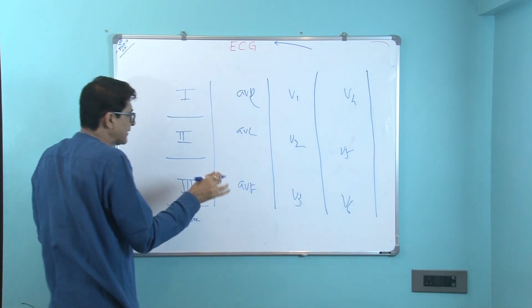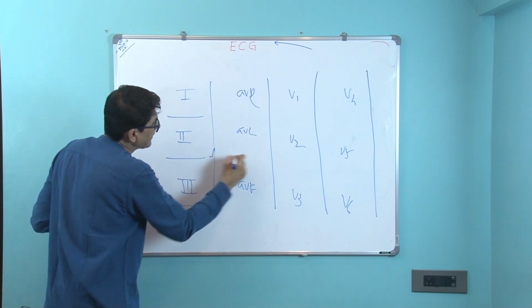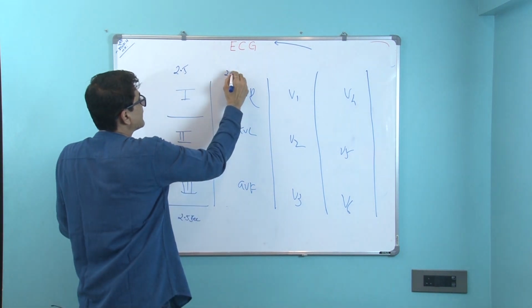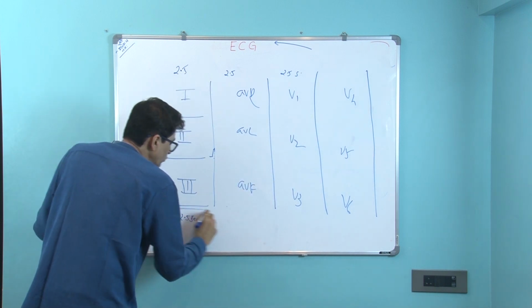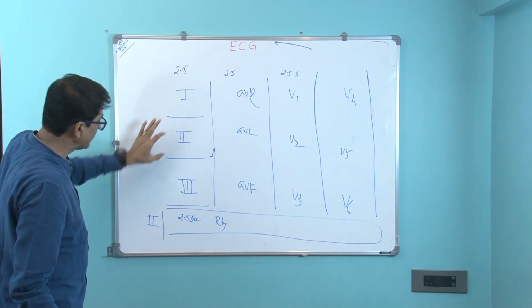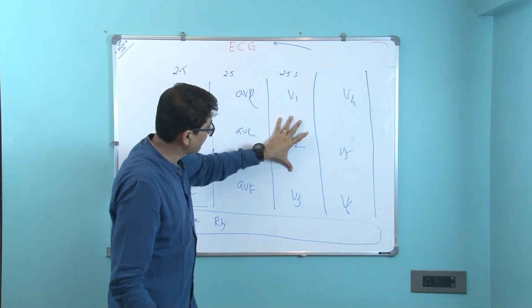So how much complex does it come? Even if an R wave is coming here, it will automatically get cut off and another lead will start from here. In a new machine, usually in auto mode, it is 2.5 seconds, and below you many times find a 10 second rhythm strip. Usually it is lead 2, continuous 10 seconds here, while the leads above are 2.5, 2.5, 2.5, 2.5.